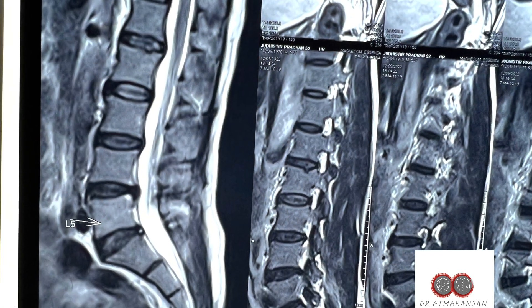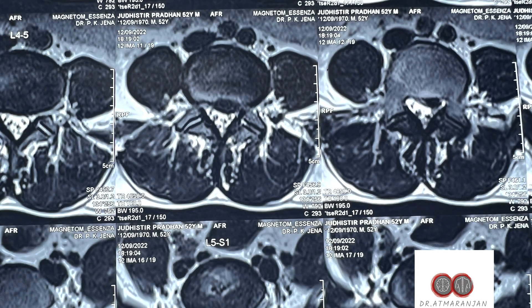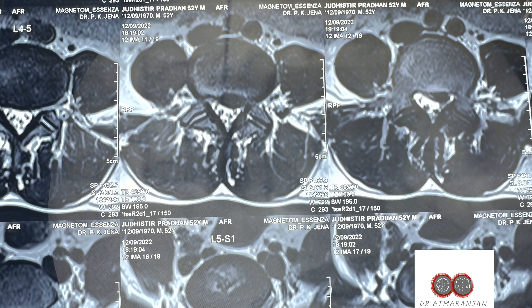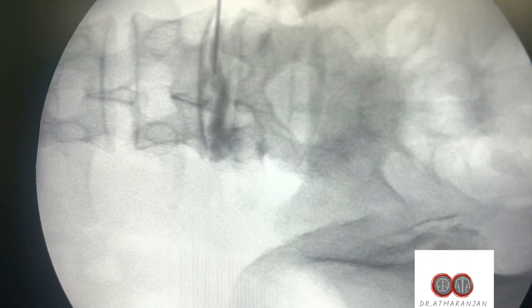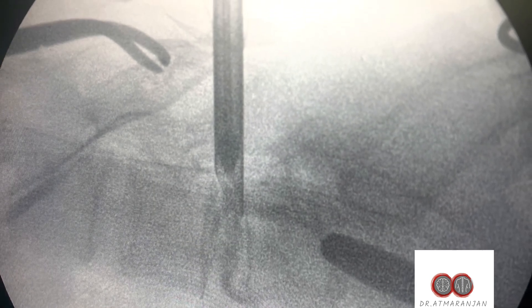This is an L4-5 disc — a left-side paracentral disc which was compressing the nerve root. We planned for an awake procedure. This is the first needling step, where we use methylene blue dye to visualize the degenerated disc fragments during surgery.